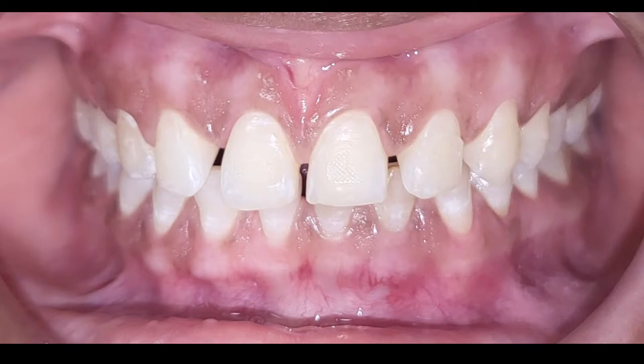See, it's almost half an hour to 45 minutes. Almost 6 teeth are done. It doesn't take much time. It's been 40 minutes if you started around 11:20 or 11:25. Okay, so I'll use a connector to connect the air rotor burs to the micromotor.